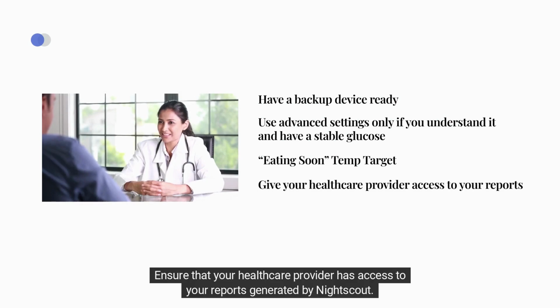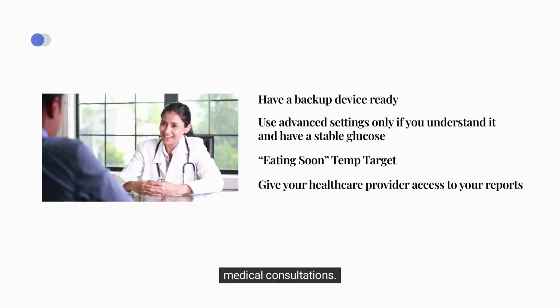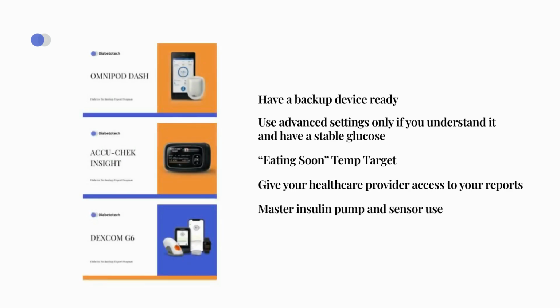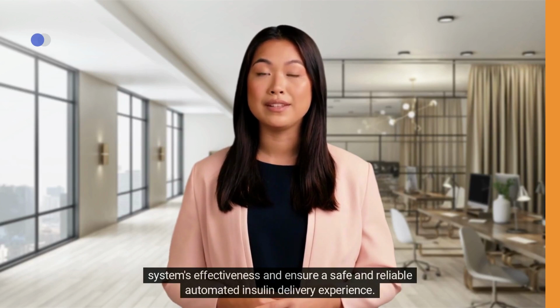Ensure that your healthcare provider has access to your reports generated by Nightscout. This enables them to stay informed about your diabetes management and make informed decisions during your medical consultations. Make sure you are able to use your insulin pump and sensor properly as well. By following these guidelines and maintaining a proactive approach to using AndroidAPS, you can optimize the system's effectiveness and ensure a safe and reliable automated insulin delivery experience.